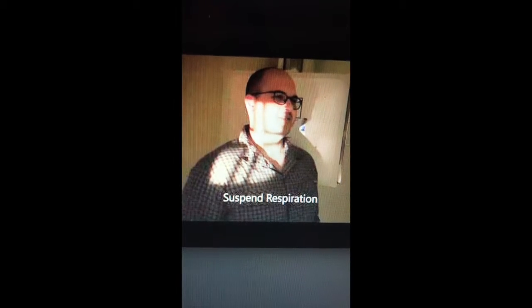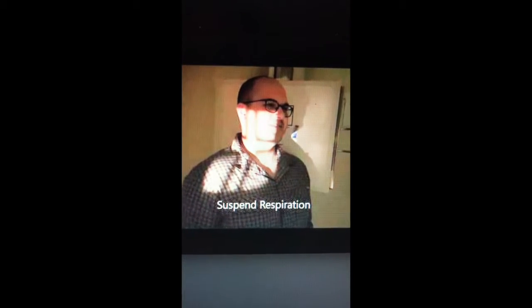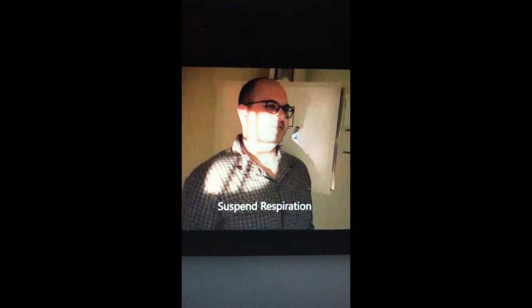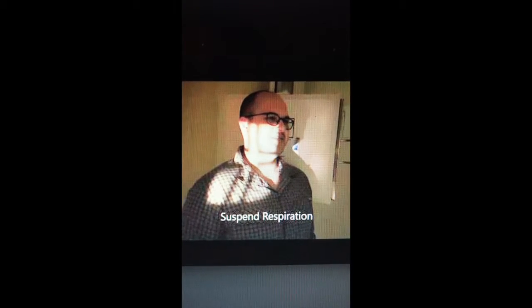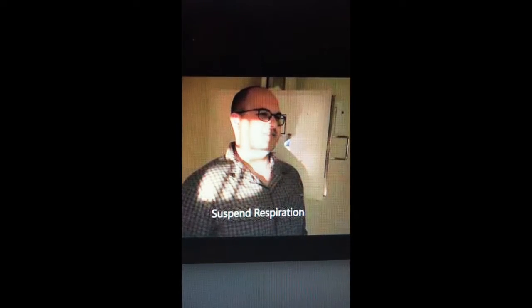This view is called the oblique C-spine. Some of the factors that need to be used on this are the same as the other C-spines, 75 to 85 if it's digital. In this position, it's mostly preferred to do anterior obliques because of reducing the thyroid dose for the patient.